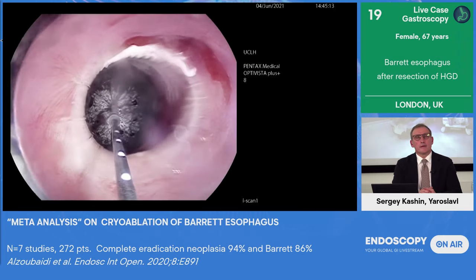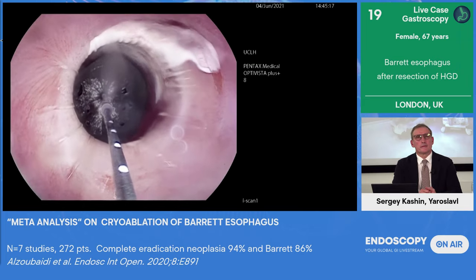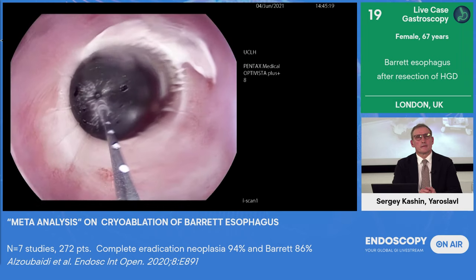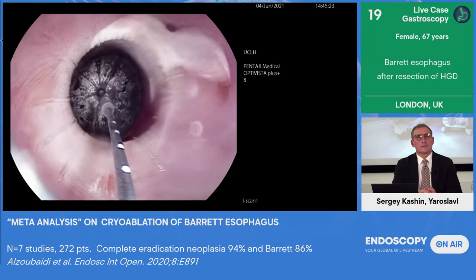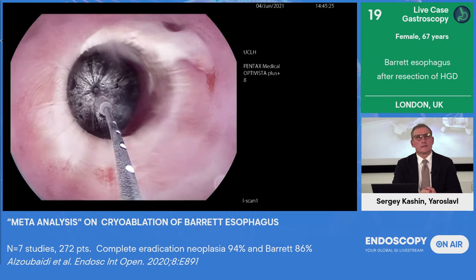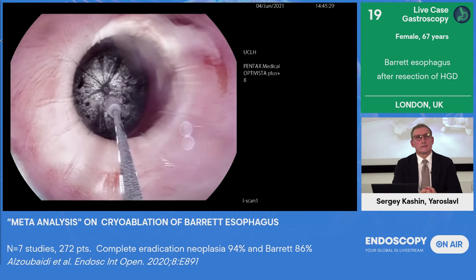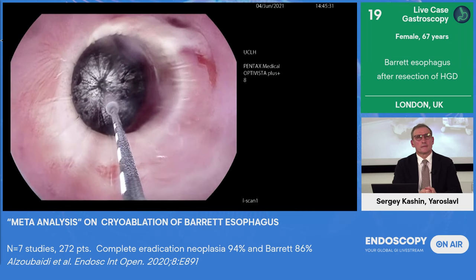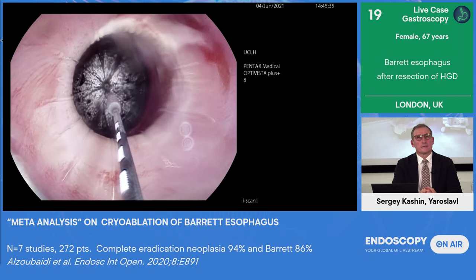And I'm happy with that. So you can see how the balloon has really helped me to guide my spray into that island that was up in the 1 o'clock position. Now I know, even though I can't see it, that on the contralateral wall in the 6 o'clock, 7 o'clock position, just tucked away behind the stricture, there's a little bit of Barrett's.